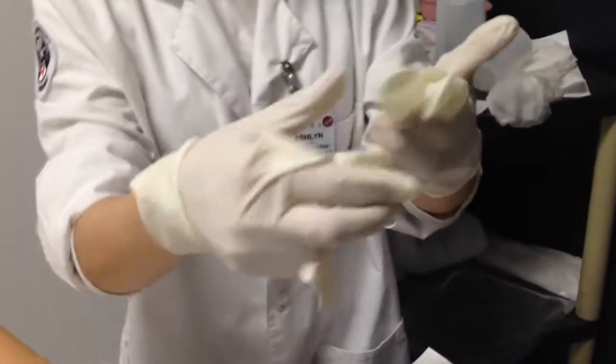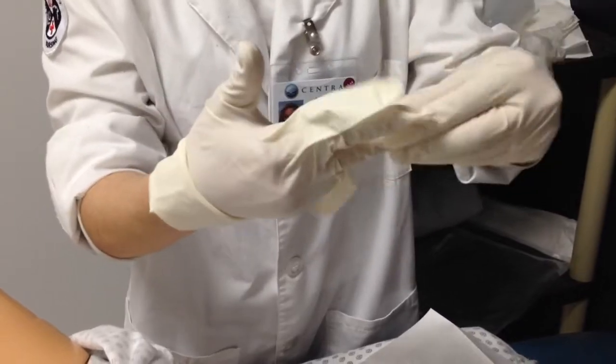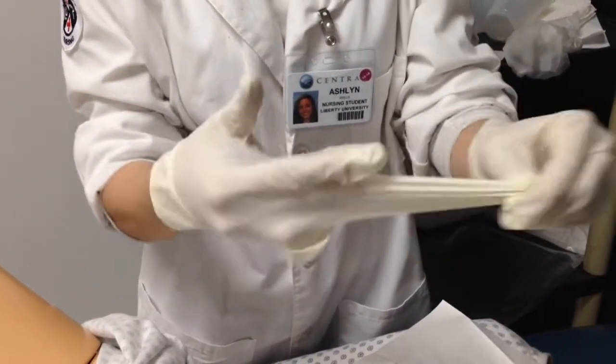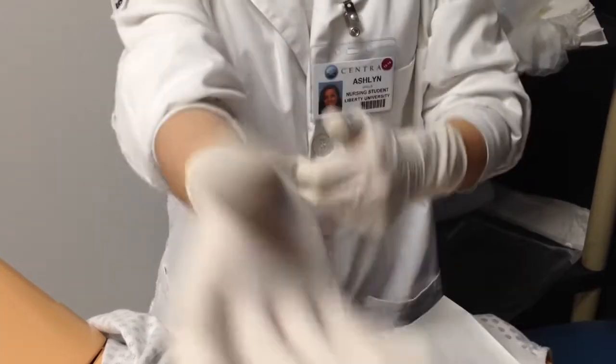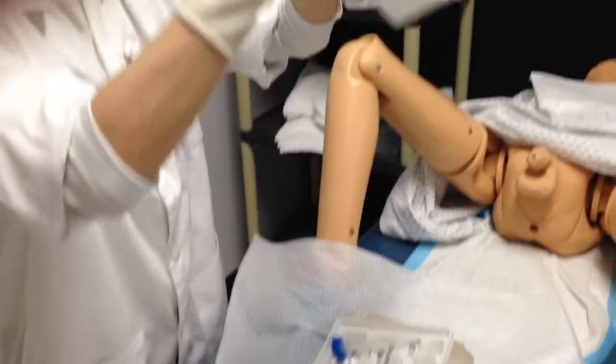From here I can go ahead and fix my gloves. Now that both my hands are sterile. Alright, Mr. Jones, so now I'm going to start the process of inserting your catheter. I'm going to go over here. My hands are sterile, so I can go ahead and pick up the sterile field with my hands.